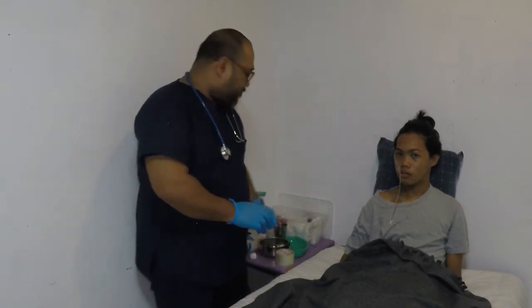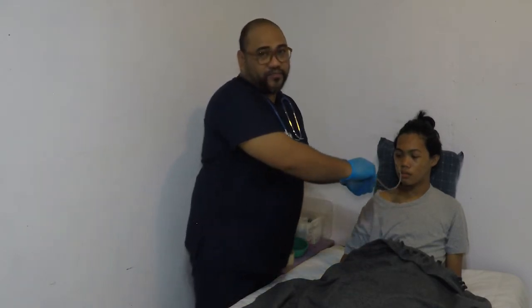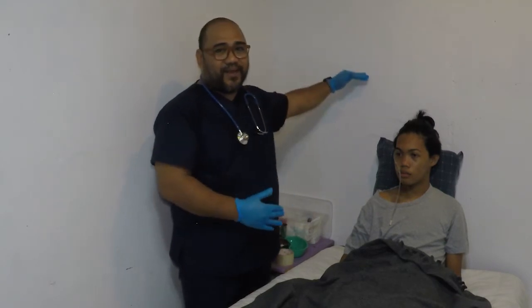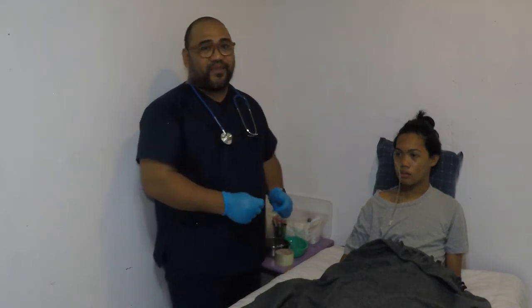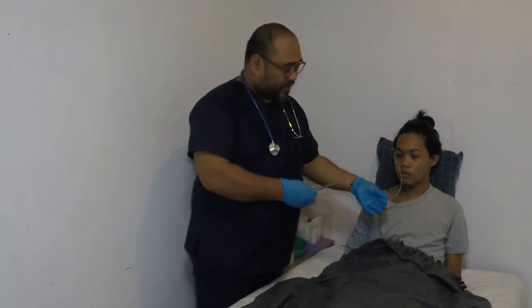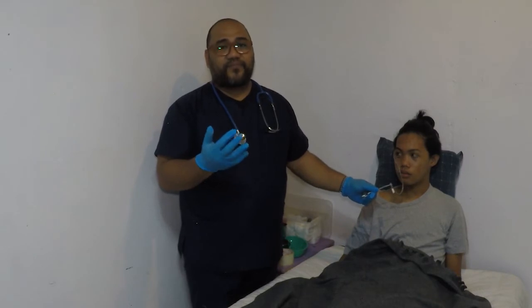For intermittent or bolus feeding, if we're going to use a feeding bag, we insert the tube here and then hang the feeding bag. Hang the feeding bag at least 12 to 18 inches above the stomach. Then clamp the tubing. Fill the bag with the prescribed formula and prepare the tubing by opening the clamp. We have to clamp the tubing, and then attach the end of the setup to the gastric tube.